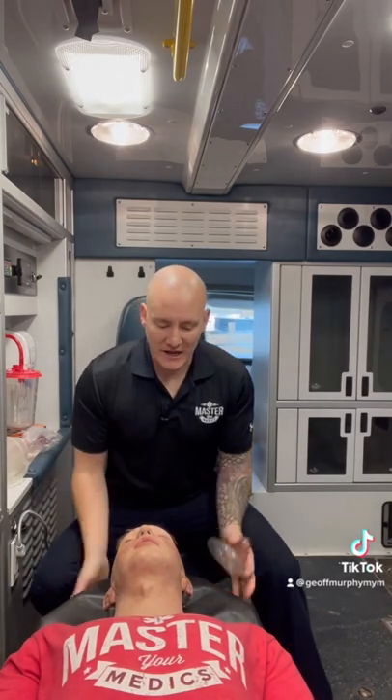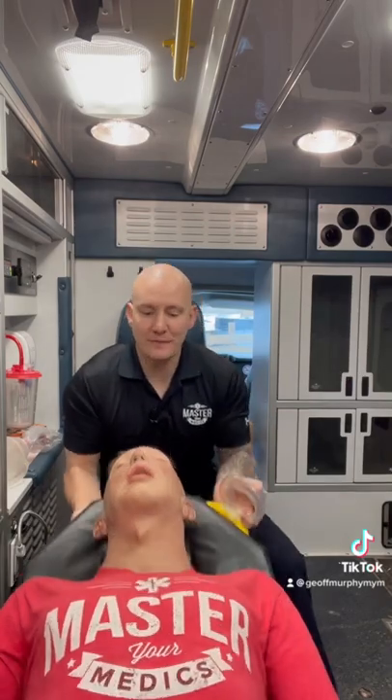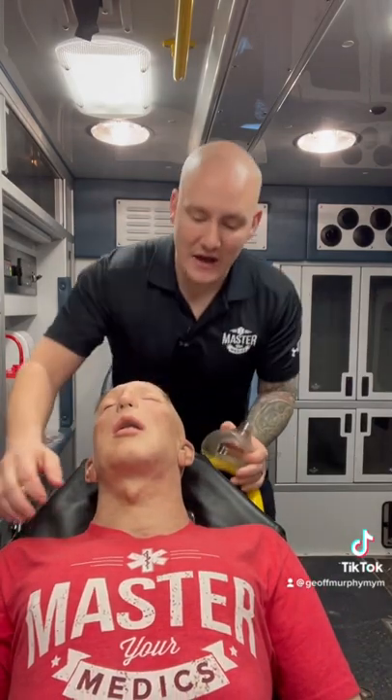Get the patient upright. In a flat position, the facial structures and a lot of the tissue are going to fall backwards towards the stretcher, meaning the seal on the mask is not going to be great. So first off, get the patient up as high as we can — that also takes a lot of weight away from the chest, so we're not fighting against all that chest weight they may have.